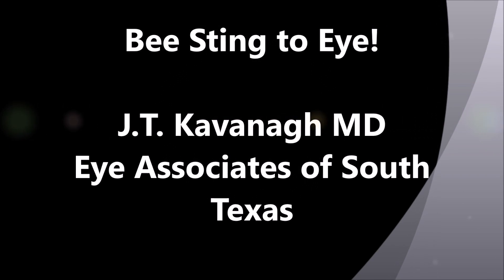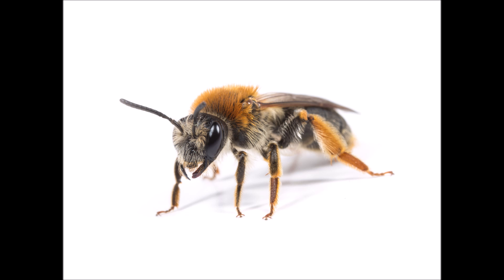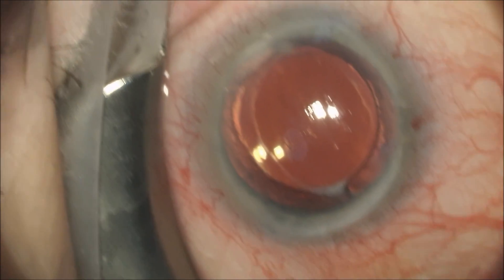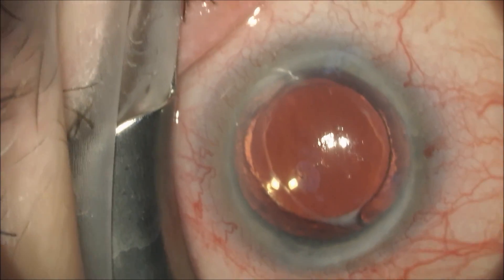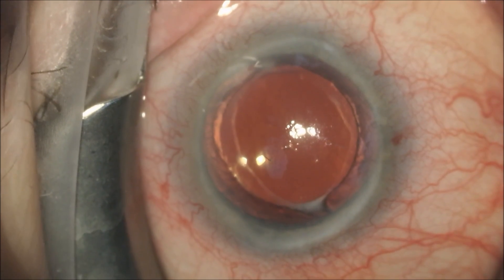This is Dr. Kavan of Eye Associates of South Texas. I'm going to show you a video of a patient who was stung in the eye by a bee and the stinger was retained in the cornea. This patient was stung over 300 times after he ran over a bee's nest and was unable to escape the insects. This is a video showing the cornea of the patient and I will zoom up with the microscope to show you the bee stinger.